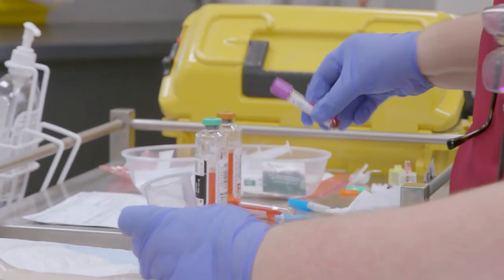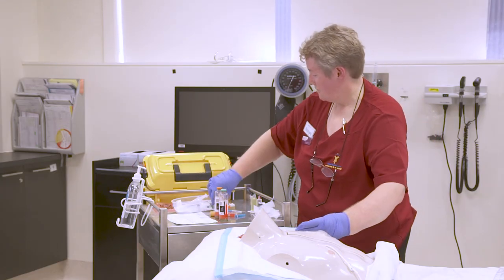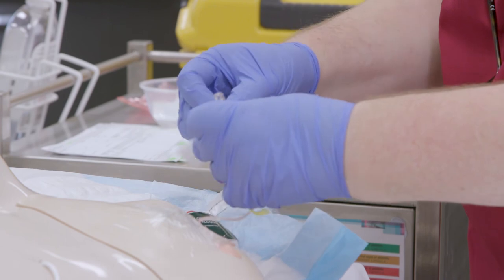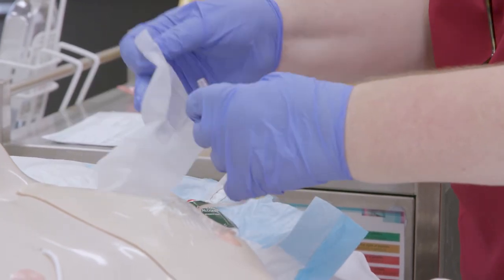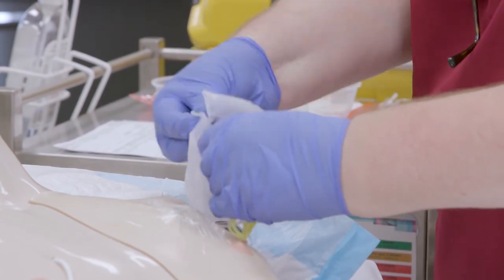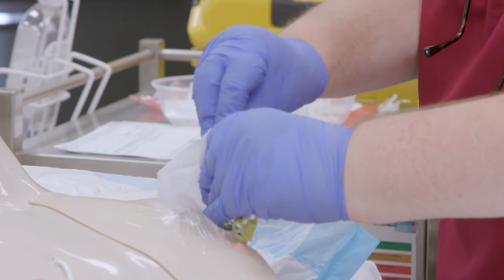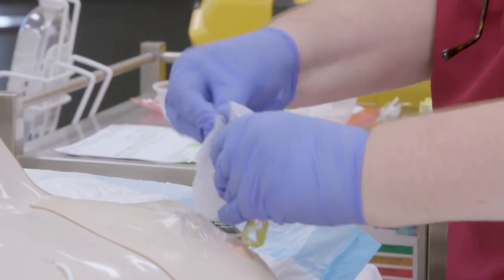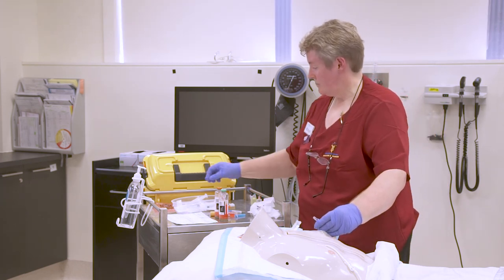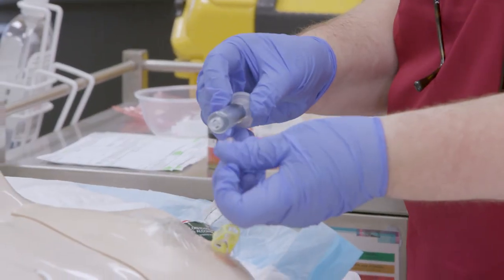Once you've collected all your bloods, now you can remove your Vacutainer. At this stage you may need to actually scrub the hub again, depending on how contaminated it is. Again, allow it to dry.